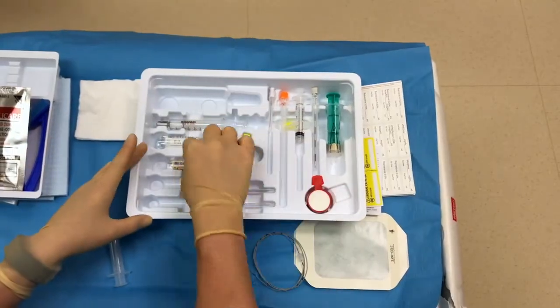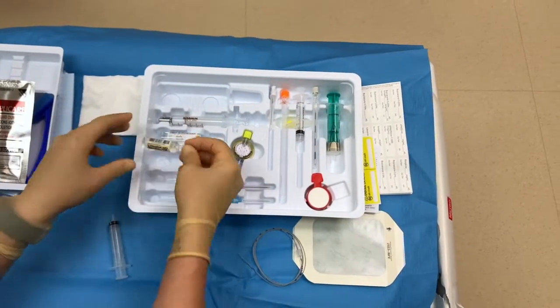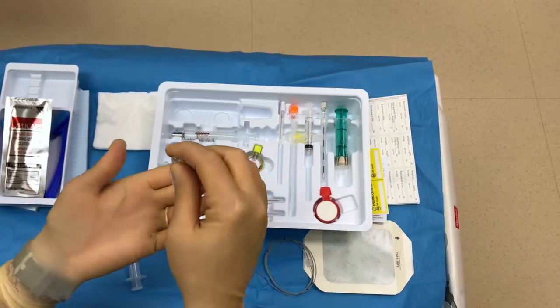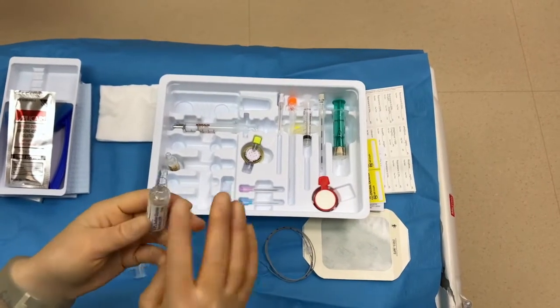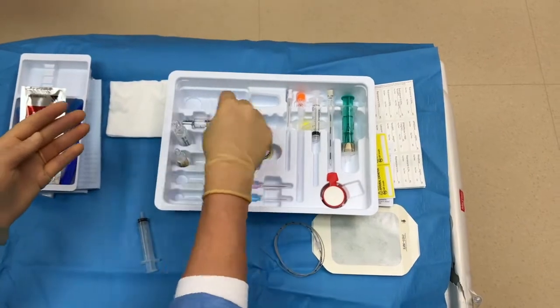Okay, so here's the basic contents of the combined catheter, or CSE. Get this out. You have your local, your 1% local. That's going to be your numbing medication. You've got your sterile saline. This will be, if you use saline for the loss of resistance method, as I typically do, you can also use this at the end when you need to flush your filter. So that's an important one to have.